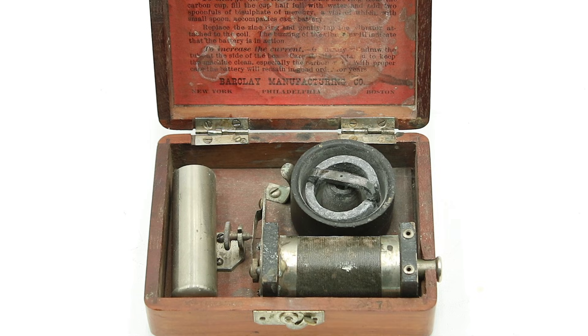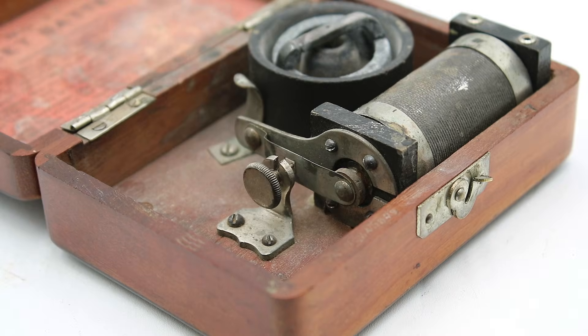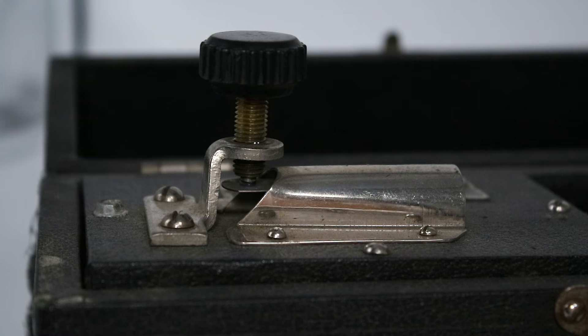Despite being so small, this unit incorporates all the same basic components as the larger medical batteries we've covered. In particular, the induction coil itself, which has a primary winding on the inside and a secondary winding on the outside with a larger number of turns to step up the voltage supplied by the battery. On one side of the coil we have the interrupter. When the coil is energized, it produces a magnetic field that attracts this little reed switch, breaking the contact, collapsing the magnetic field, and causing the reed switch to snap back into place, completing the circuit, re-energizing the coil, and starting the cycle over again. This produces an oscillation with a constantly varying magnetic field that allows the induction coil to operate.